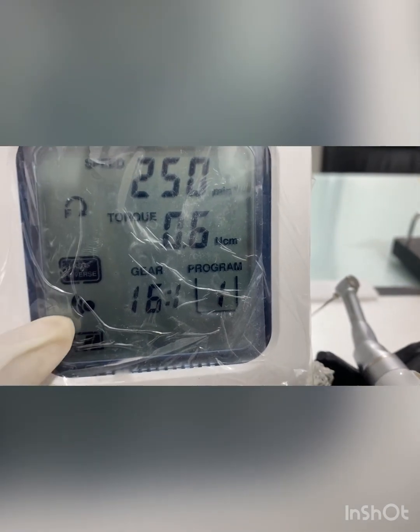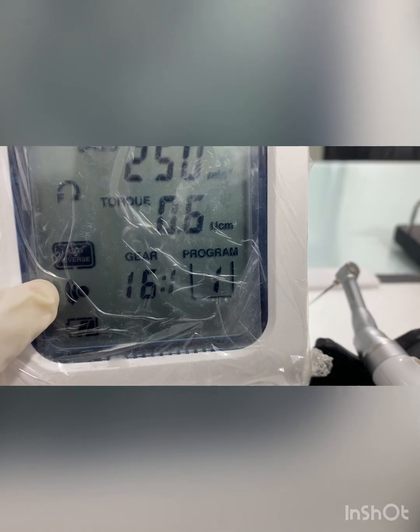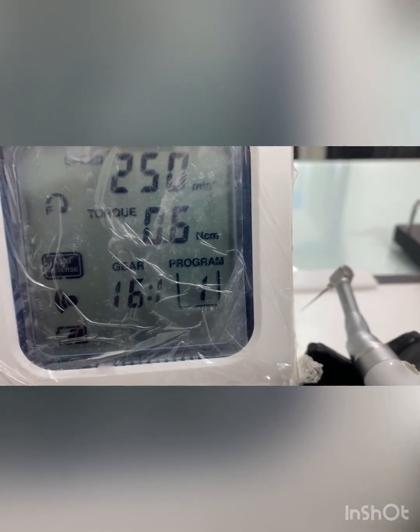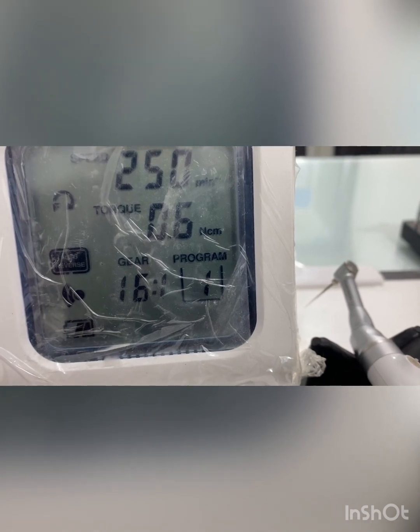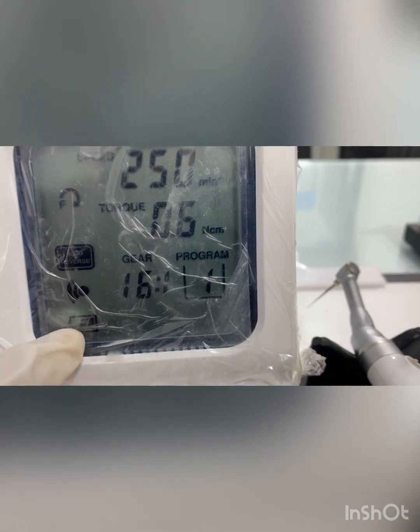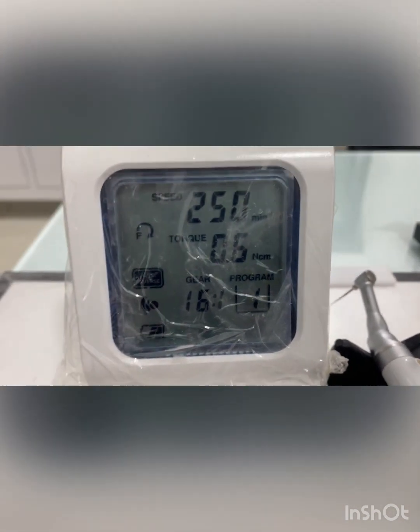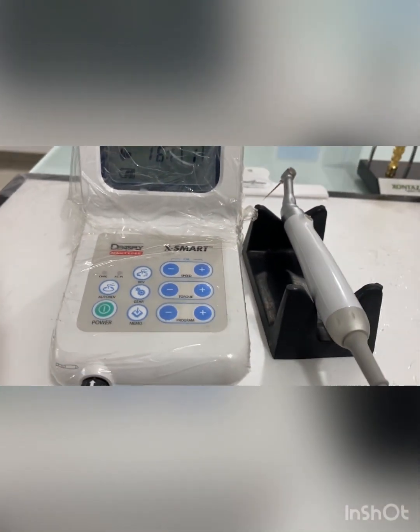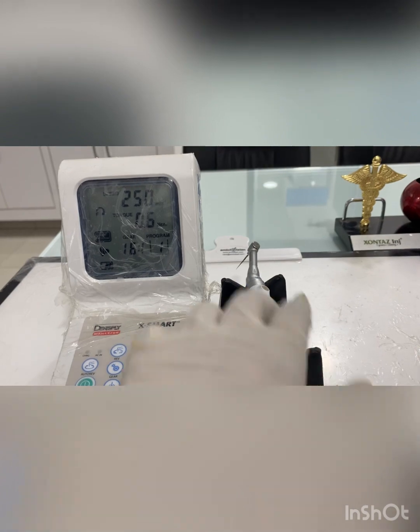There is an alarm symbol — whenever you exceed the torque or speed limit while using your file, this alarm will beep. There is also a battery charging percentage symbol shown on the LCD. That covers everything about the control panel and control unit.